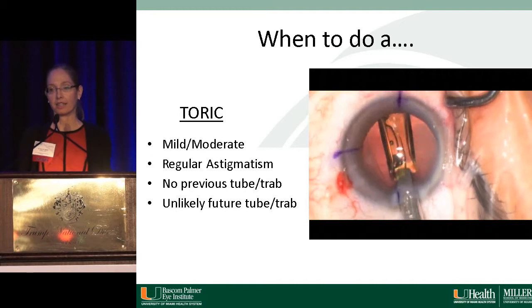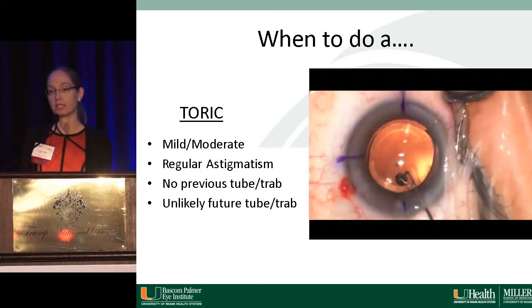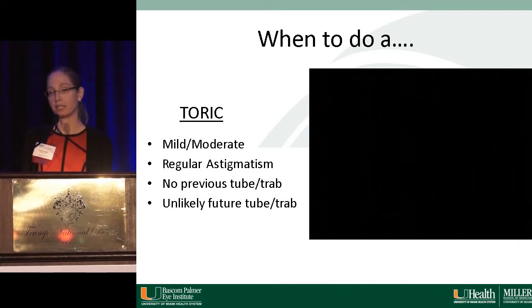Toric IOLs I think are extremely good and helpful in a large group of patients, even those with glaucoma. But something to keep in mind is that patients that have had glaucoma surgery, or may have glaucoma surgery in the future, may be prone to having irregular astigmatism.